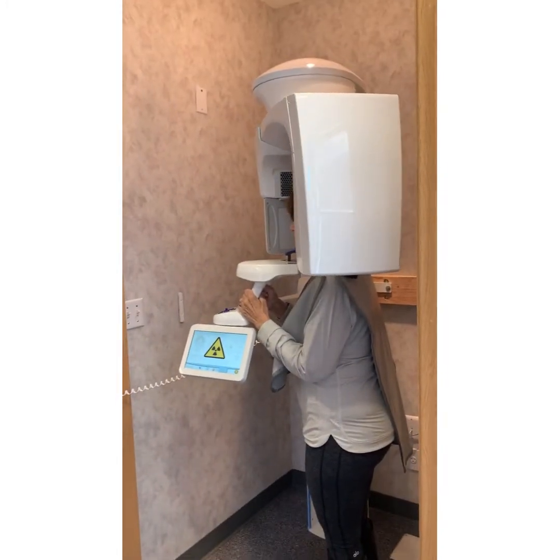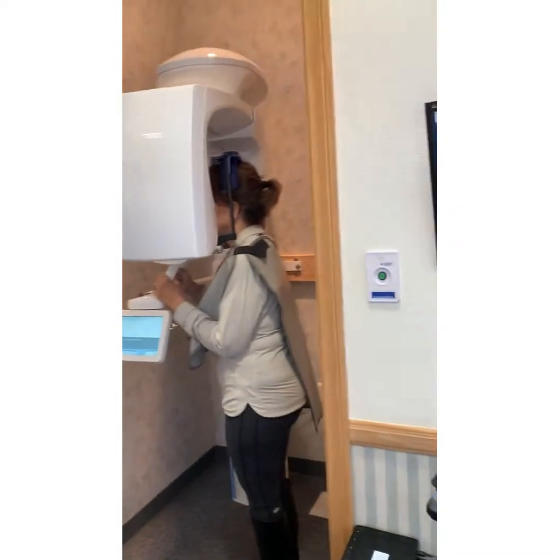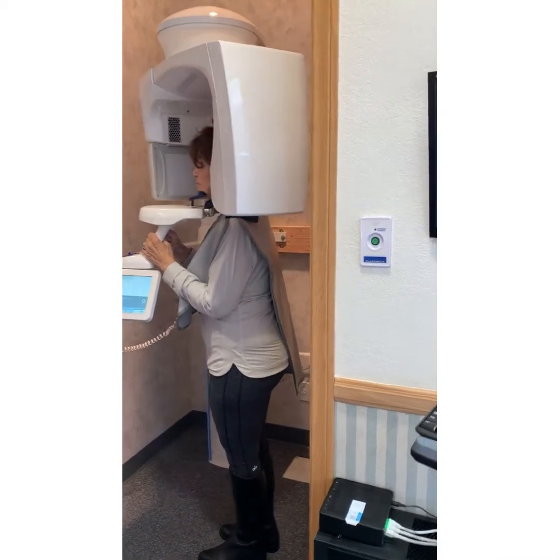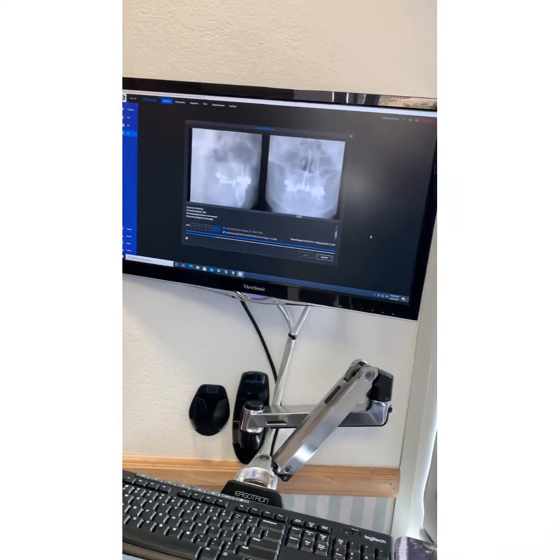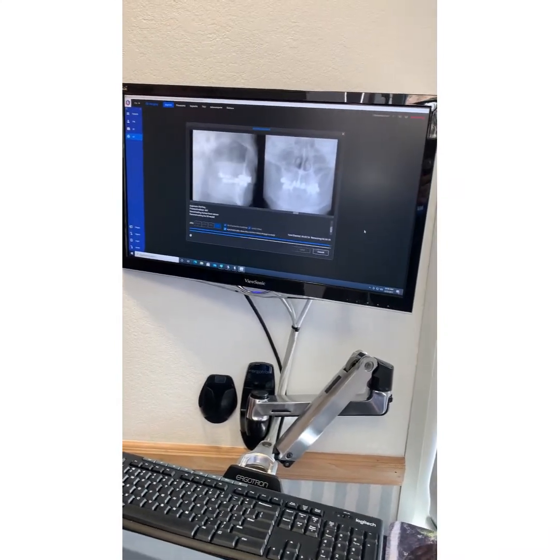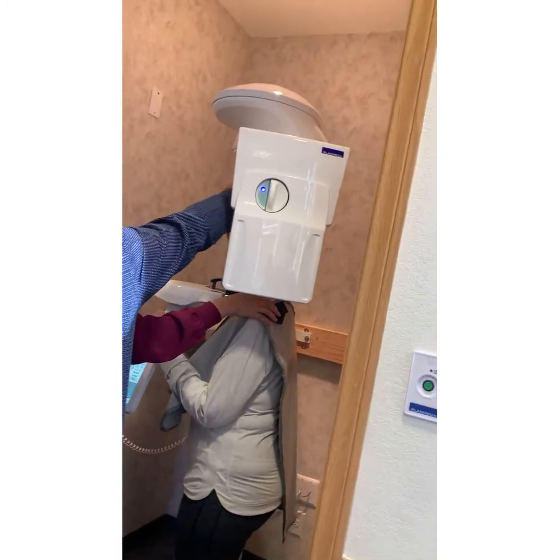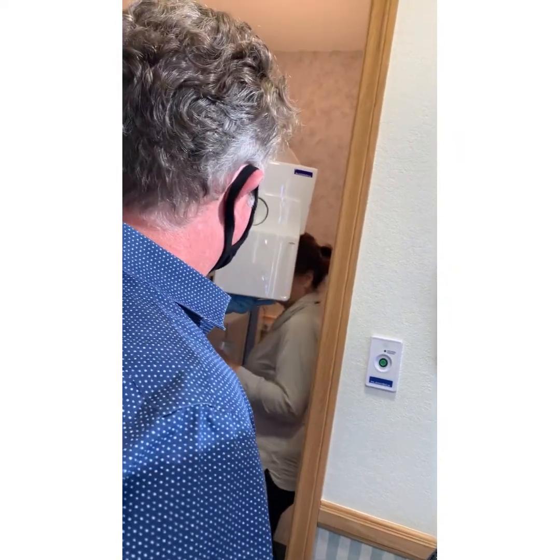And after 10, you're just going to count to 3 and then you stop. After 20, now you can hang it. It's going to go back around before she gets out. These are from the torture chamber. Thank you, Pam, for being our guinea pig. Our test study. Have you step out, watch your hand when you come out.